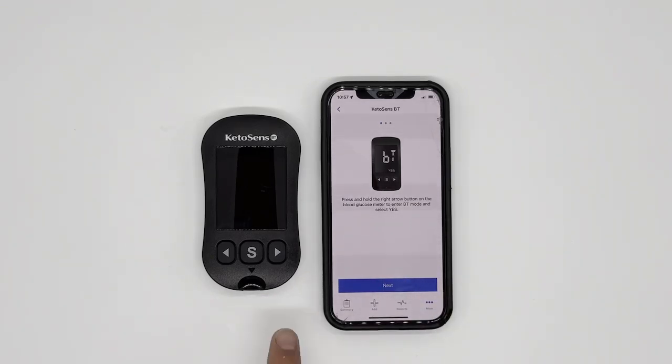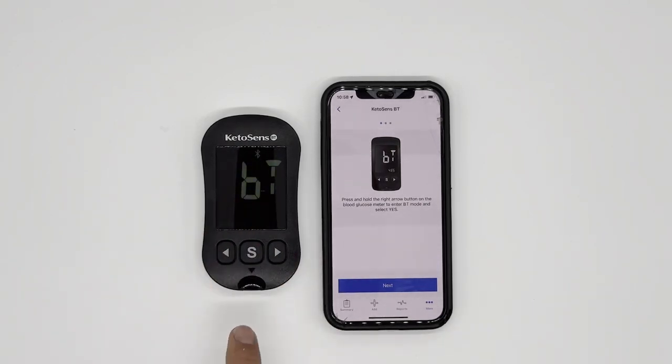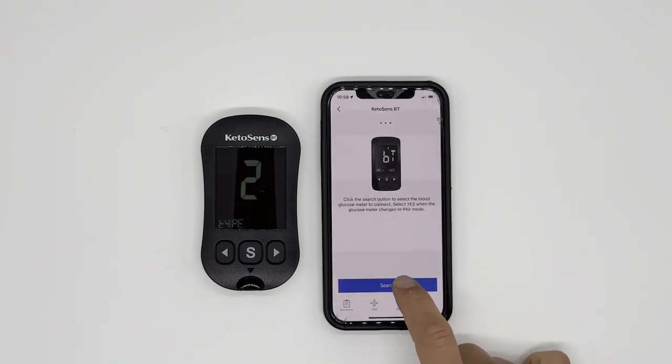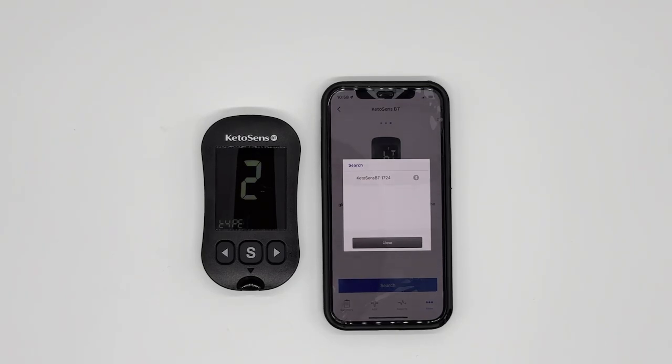When you see this screen, please press and hold the right arrow button for three seconds. From there, you're going to see 'BT Yes' blinking. When you see 'Yes' blinking, just click the S button. You'll see the number 2 on the meter and on your phone. Select one or two — of course, you choose two. Now press 'Search.' You will see KetoSense BT with four digits.